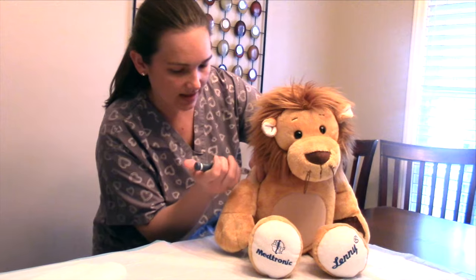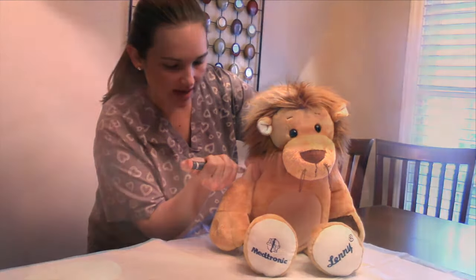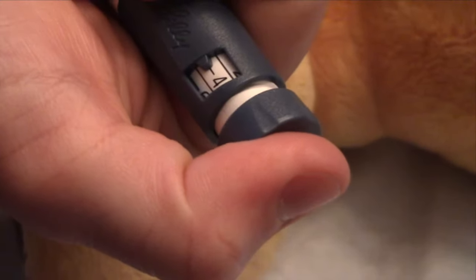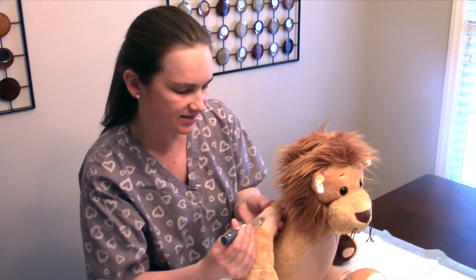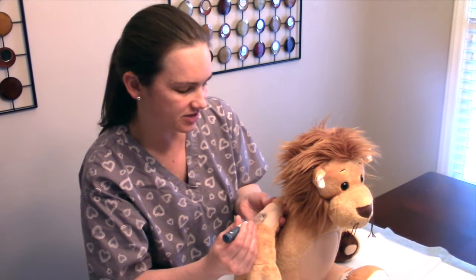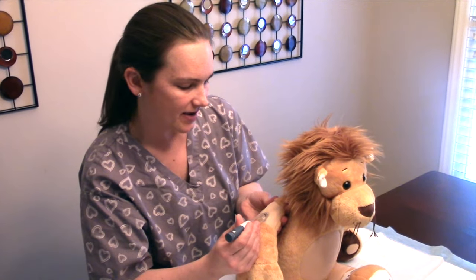You just go right in, and once you're in, you push on the top and watch that number go to zero. Now comes the hard part: waiting for 10 seconds to ensure accurate administration and that the insulin does not leak back out onto the skin.